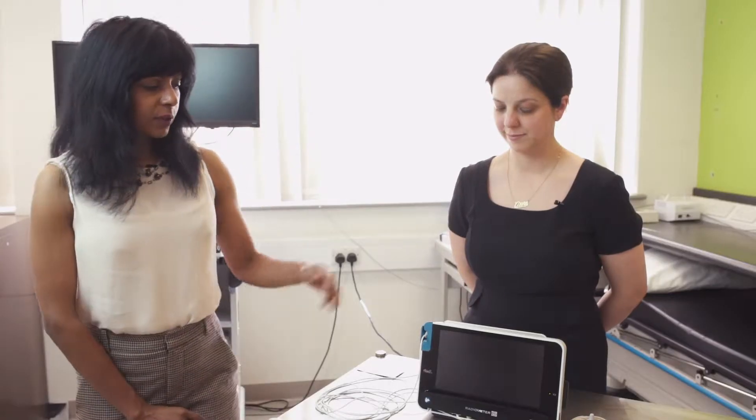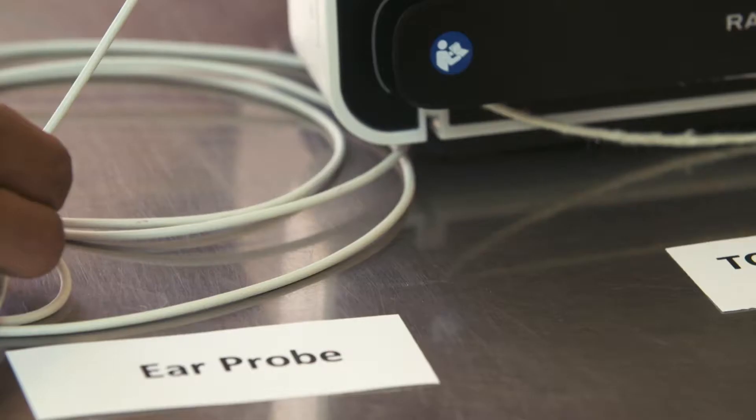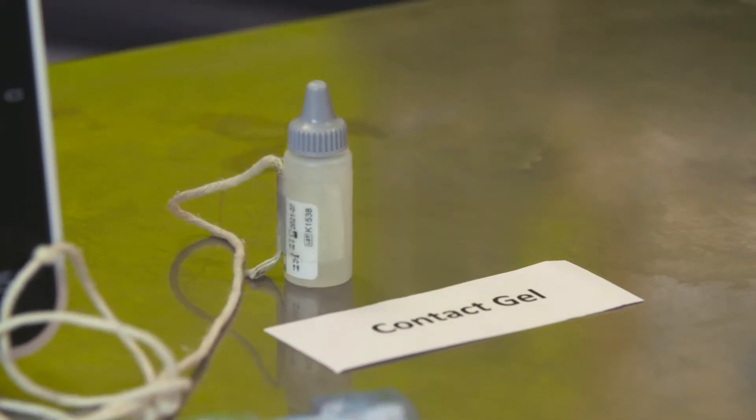Your clinician may want to measure the oxygen and carbon dioxide levels in your blood at night time using a Tosca device. This consists of a Tosca machine and is attached to you by an ear attachment clip, and there is an ear probe that attaches to the clip. You will also need some alcohol wipes and some contact gel, which is attached to the Tosca machine by a string.